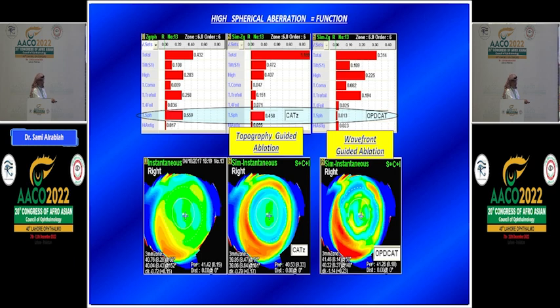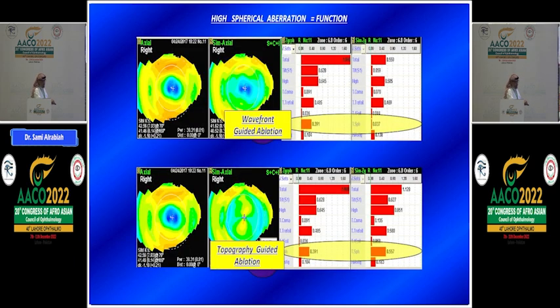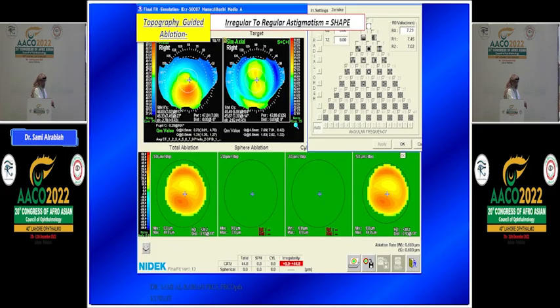You are happy here on topography. He is happy here on function. The function is the same. Look at the energy here and look down here. This is beautiful here. This is as if it has not changed, but the picture is different. So the wavefront is really correcting the abnormality.